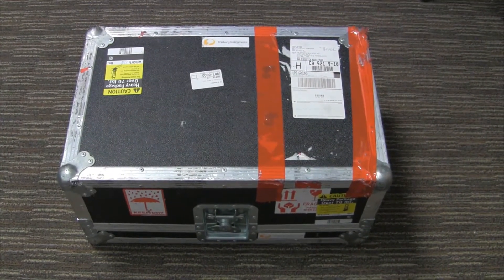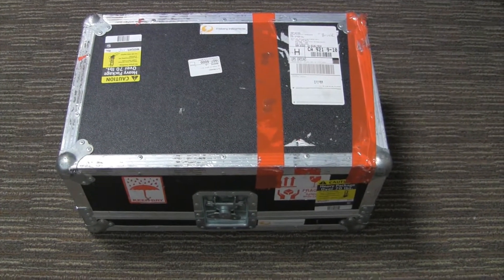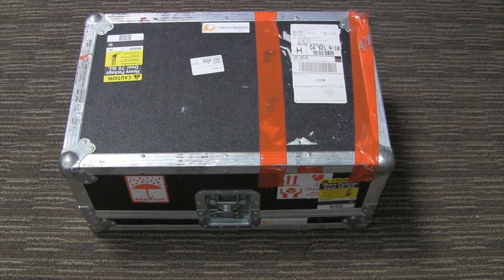Check to make sure there are no damage signs on the outside of the case. We'll also do this on the inside as well.